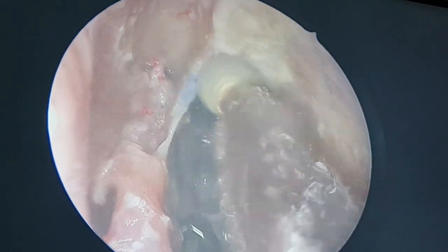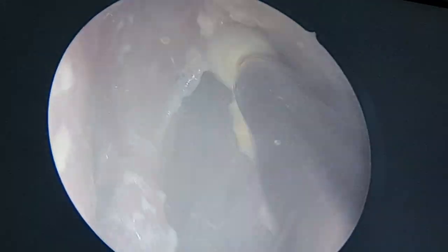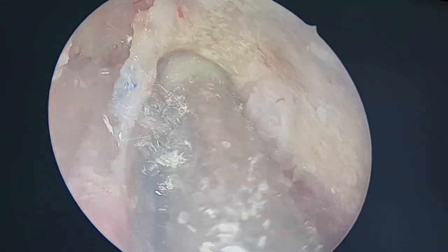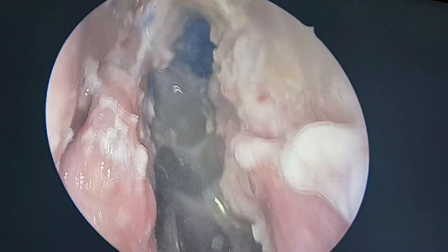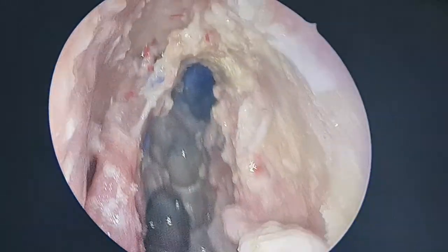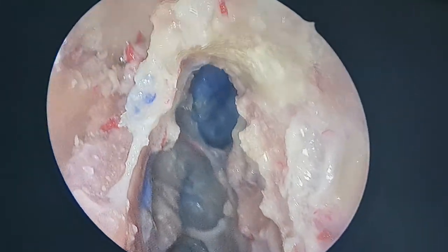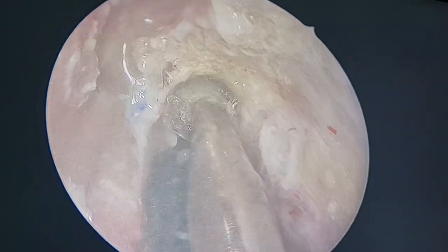Yeah, keep drilling this thick bone. Keep going anteriorly and deeper. Keep removing this, there is nothing critical in this region. The lacrimal sac is left far below here. You have it much above now. Yes, exactly. Keep drilling this anteriorly, there is nothing critical.